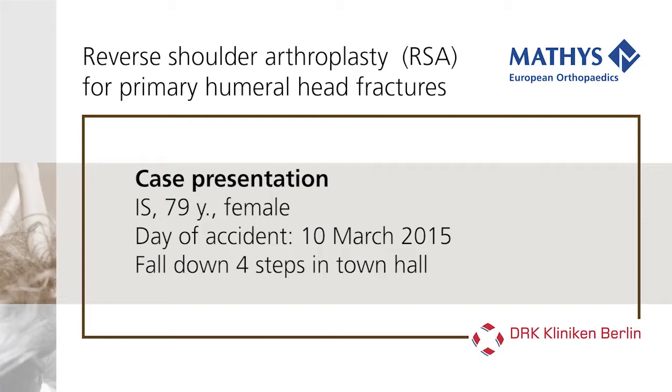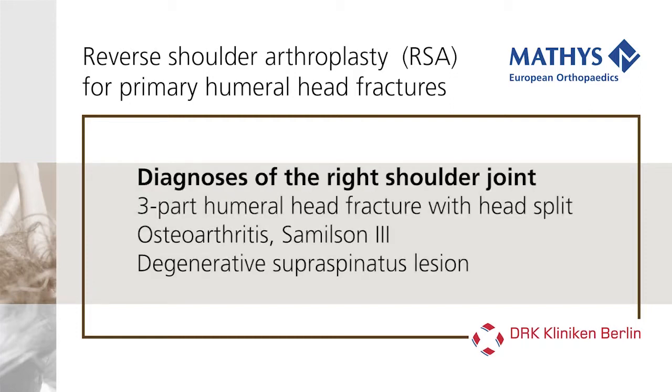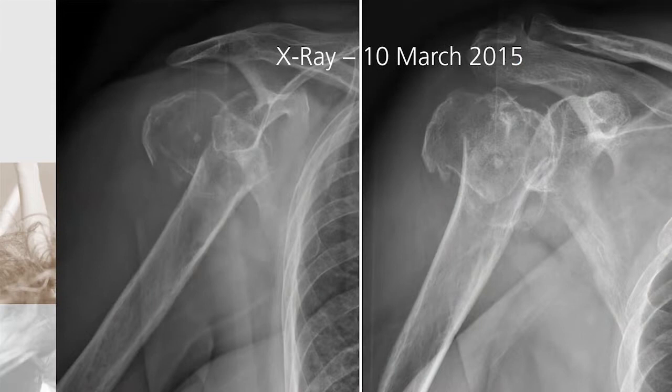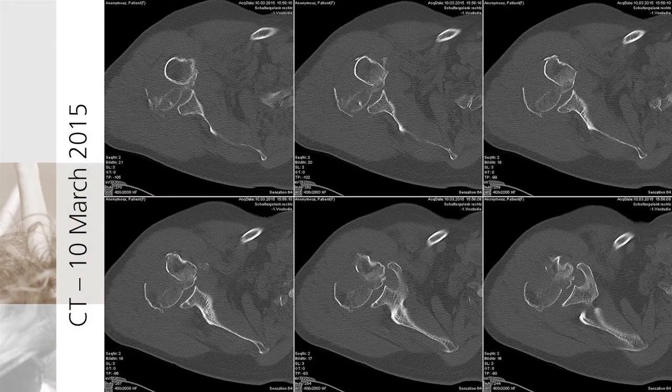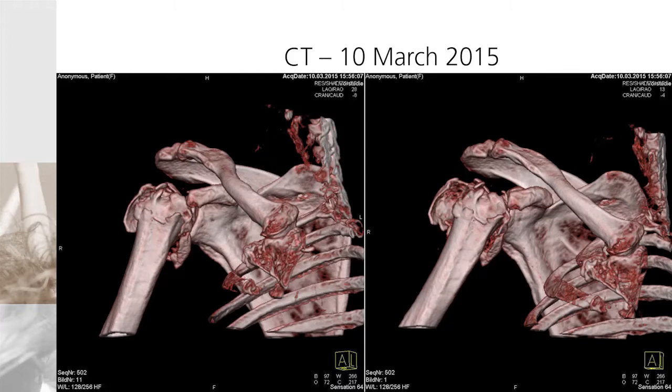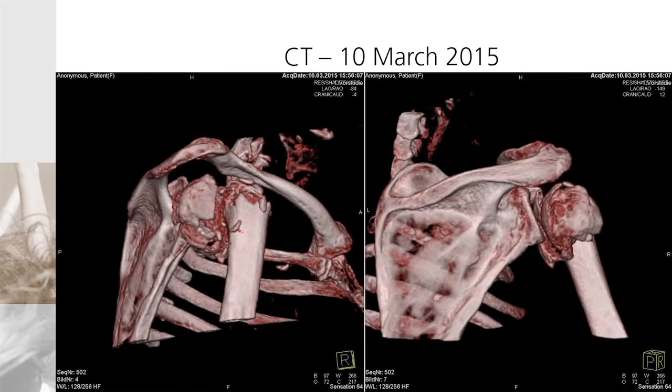The patient is a 79-year-old female who suffered a 3-part humeral head fracture with head split after a fall down the stairs. Radiologically, a dislocated multi-part humeral head fracture with significant osteoarthritis is seen. In CT, an additional head split component with varus dislocation of the humeral head fragment is visualized.